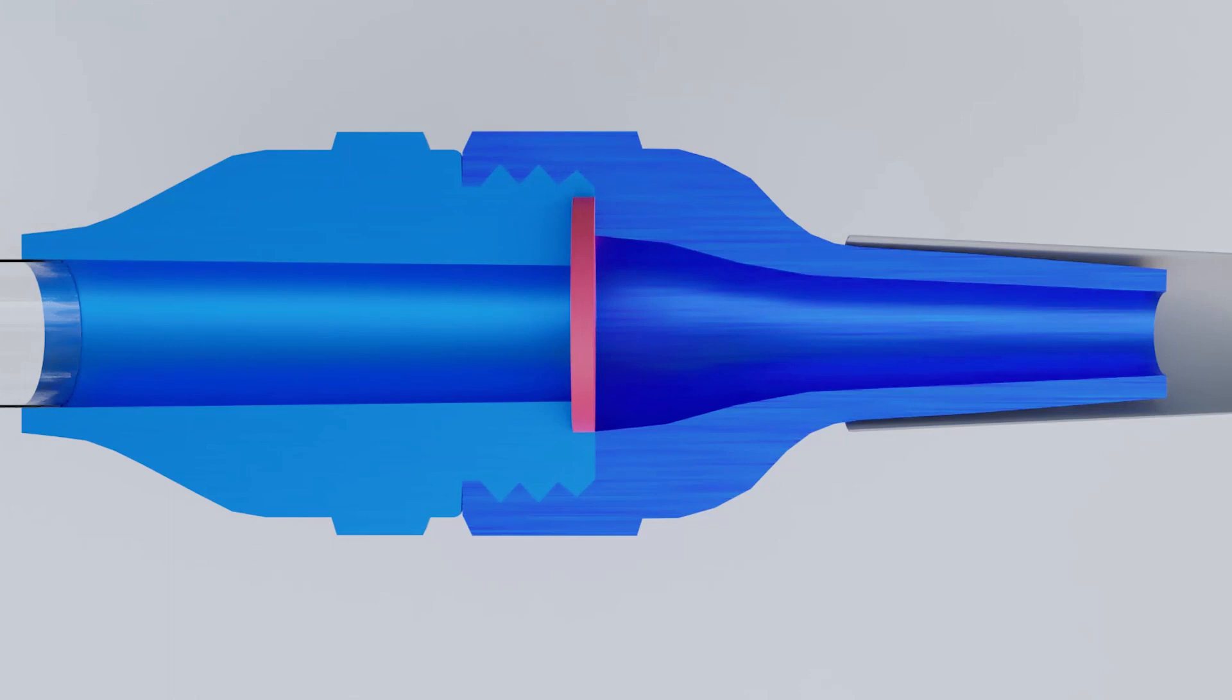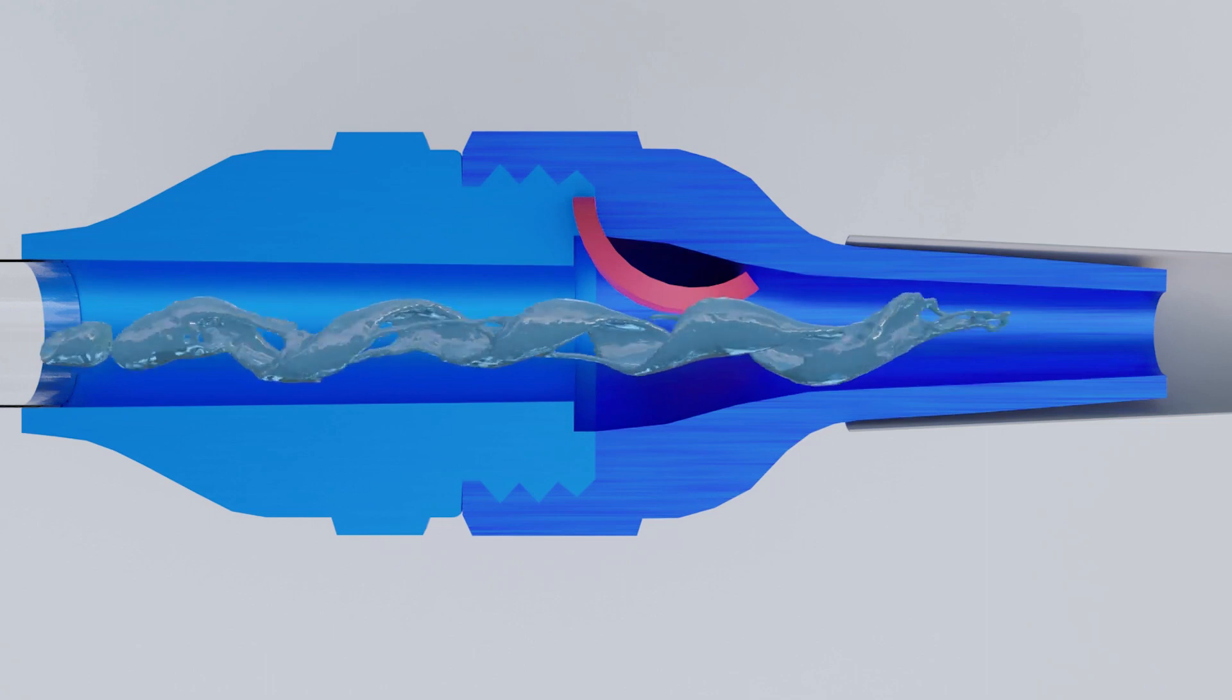When the valve is opened, the vacuum system draws air through the check valve in the low-volume evacuator. During operation, the check valve opens in the direction of air and fluid flow and remains open.